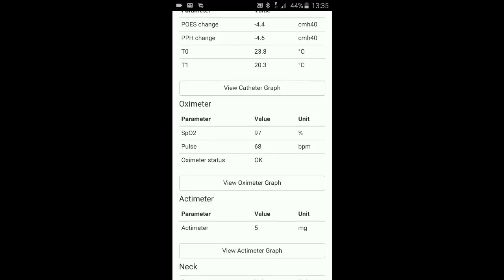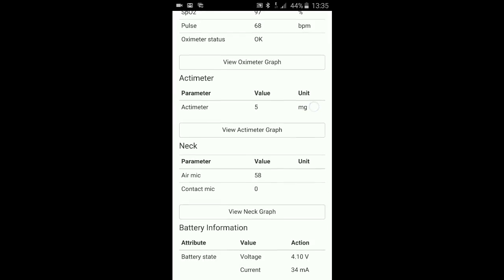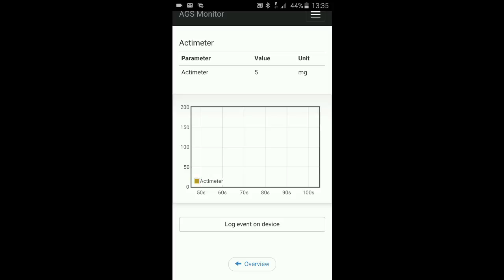I want to look at the accelerometer, which is the movement of the wrist unit. This is averaging over 10 seconds. But you can see the reaction to a smaller movement that I just made. Back to the overview.